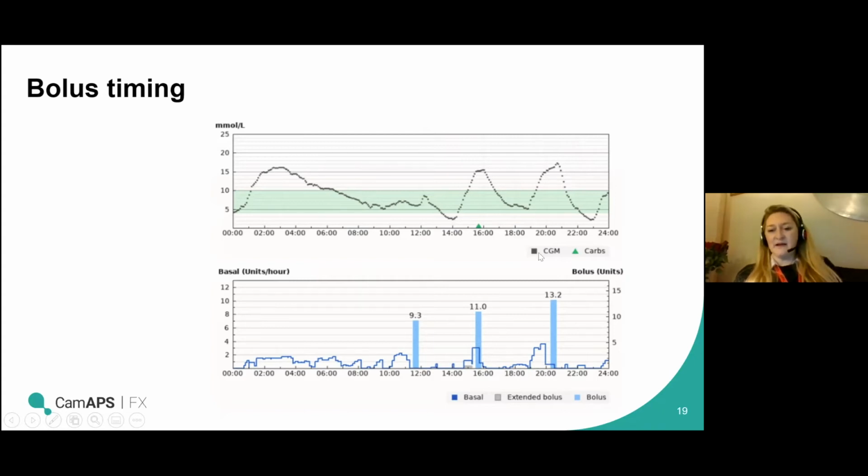There's clearly been some carbs gone in of some sort around 7 o'clock, which has caused a really steep rise. The system's ramped up to help get on top of the rise, and then the bolus of 13.2 units has gone in there, causing a really steep drop, and even though the system's pretty much backed off to deliver absolutely nothing following that 13.2 units, it didn't stop the dip from all the extra insulin that was around. So having those boluses in advance can help avoid that situation.